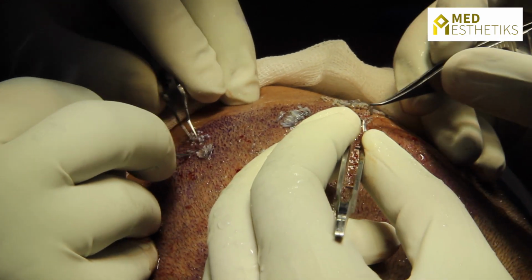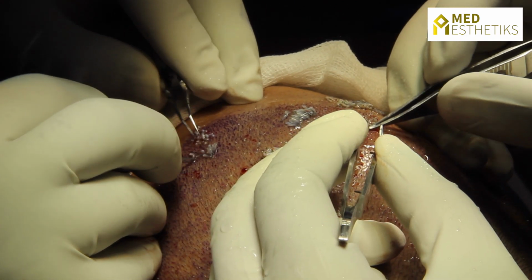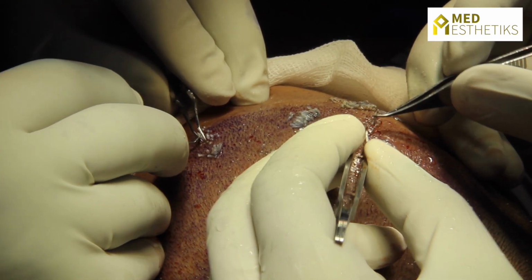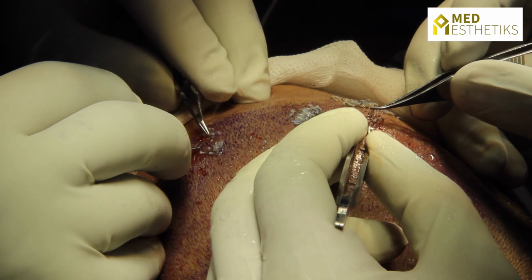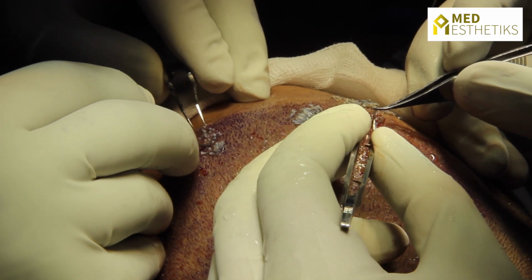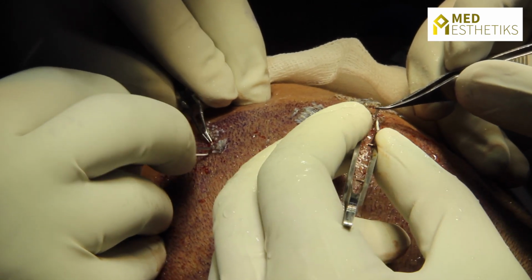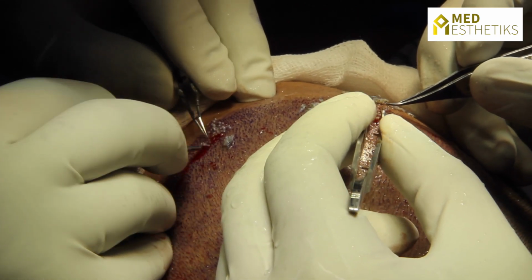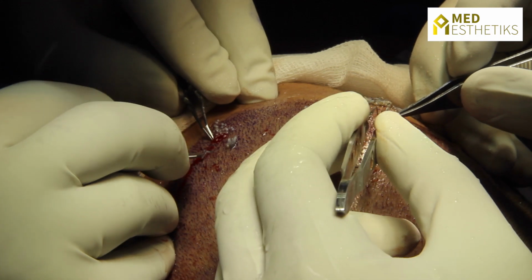The graft placement is usually done in a way that in the hairline, in the frontal area, we put single hair grafts to give a very natural appearance, and behind the hairline, behind 2 to 3 rows, we start putting 2 and 3 hair grafts.